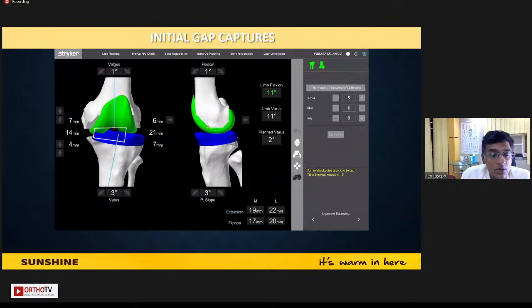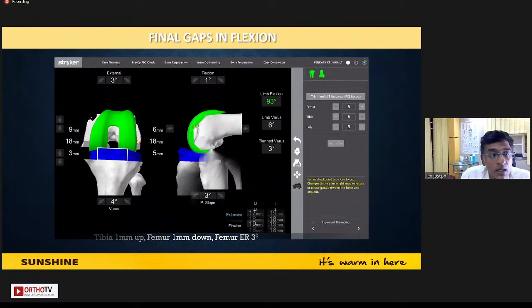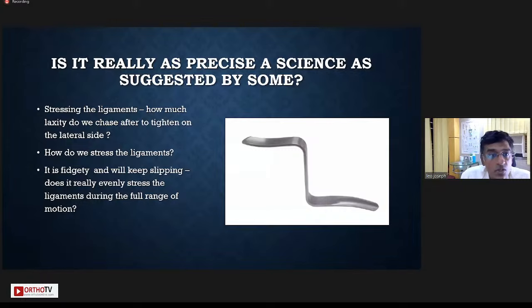However, in functional alignment, you have a three-dimensional look at the joint, and then you know how many joint gaps you have on either side. Out here, we have 14 millimeters and 21 millimeters on either side. You take your cuts in such a way that the ligament gaps are balanced out to about 18 approximately, and you have the exact amount of joint gaps and space needed to fit in your implant in both the flexion and the extension gaps.